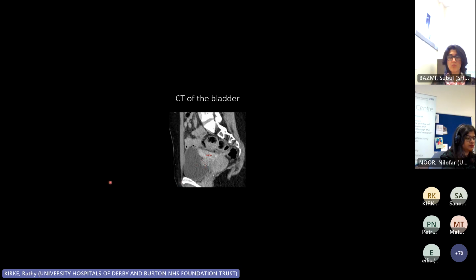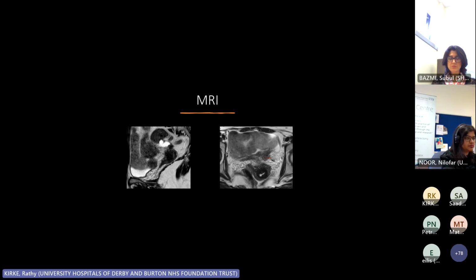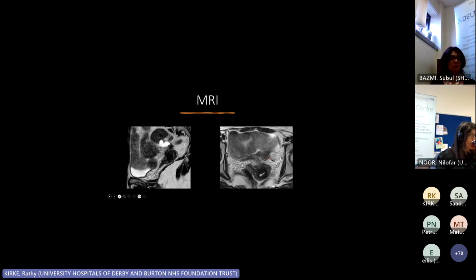She was still in a lot of pain, so we needed to get her through the MR scanner. On the MRI, we saw this dark area sitting at the back of the bladder, separating the uterus and the bowel, definitely not hematoma: irregular dark areas with tiny white cystic spaces. This was bladder endometriosis. We could confirm that on MRI. It was difficult to confirm on ultrasound or CT, but with MRI, we knew this lady had endometriosis on her bladder wall, which was infiltrating the bladder wall with each cycle. So this was something that we found quite recently, and again, it's a bit of a learning curve for us.